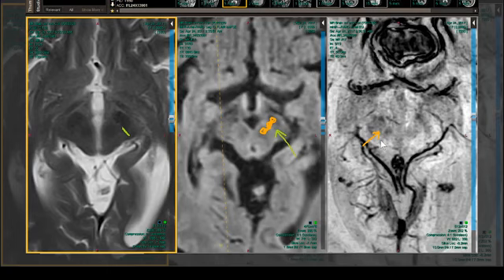The history will be defined, and instead of getting an unnecessary and potentially harmful operation, that would be a really good pickup on a dementia case that's sent to you to say, this guy's got amyloid, because then they know what's going to happen and how to handle things. So that's another part of this dementia search pattern that we're kind of developing.